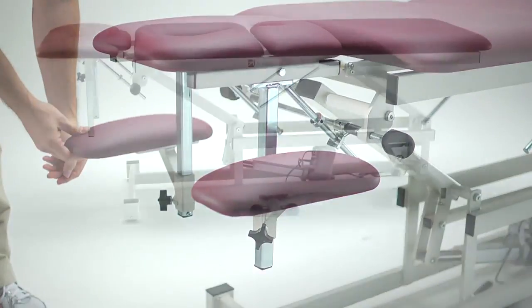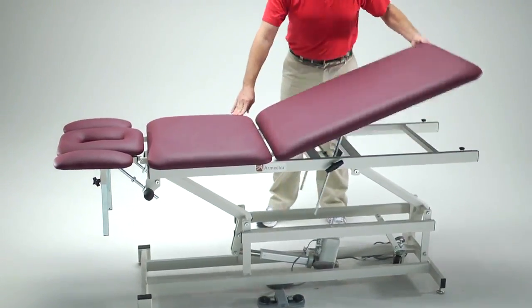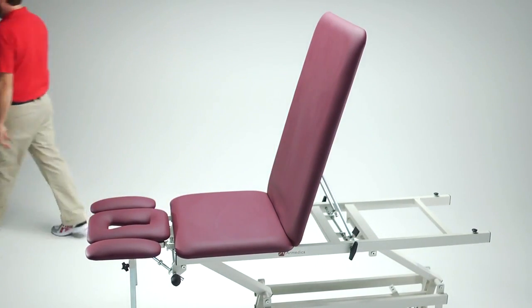In the prone position, the center section is securely fixed in a flat position, and the foot section can be raised to 78 degrees to create a comfortable backrest when the patient is in a seated position.